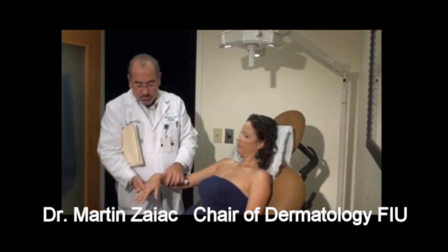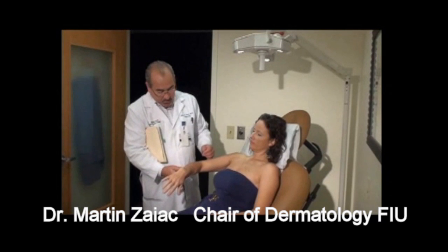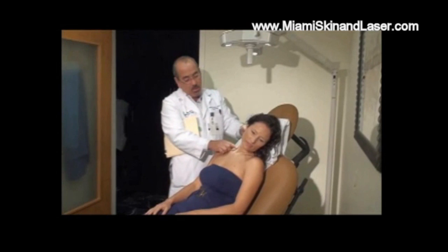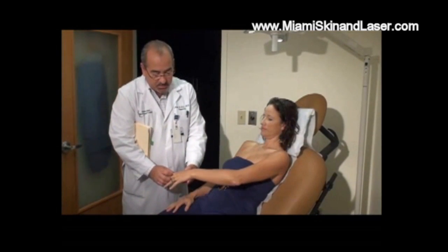Martine has a condition called vitiligo, where you can see there's deep depigmentation of her skin. She's had it on her elbows and in the neck area. You can see that she's had multiple treatments, so she's definitely getting a nice result.